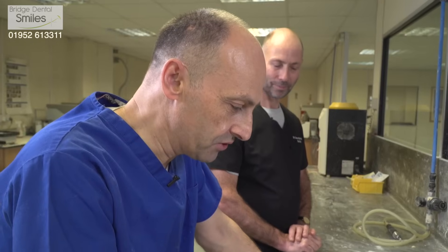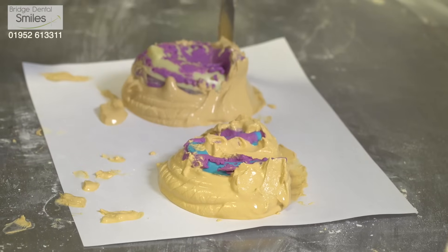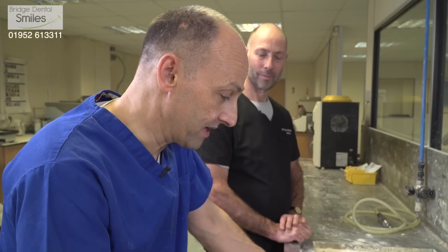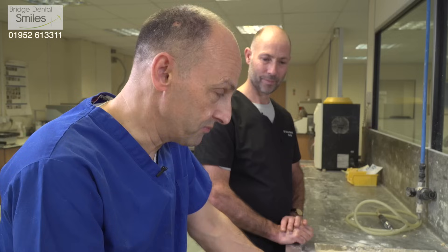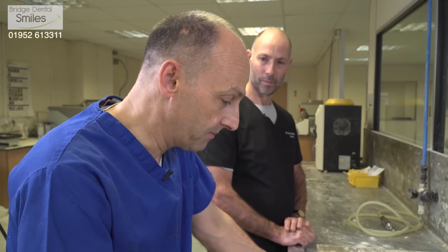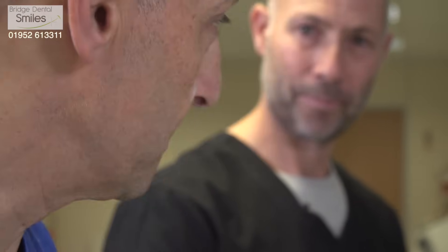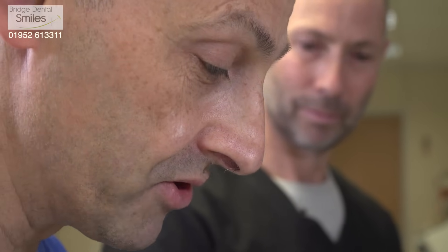If you have an initial poor impression that's underextended, or the alginate isn't mixed correctly and it doesn't capture enough of the area for us to make a good special custom-made tray, then that error starts repeating itself all the way down the line and can ultimately lead to a poorly fitting denture. I've seen results where things were done in a quick fashion and it just doesn't work well — not for the patient, not for the dentist, not for the laboratory.